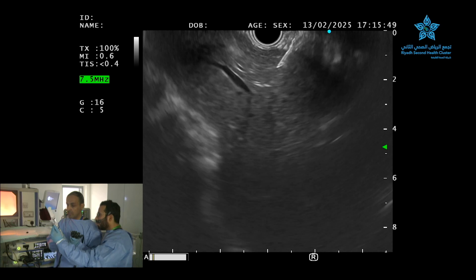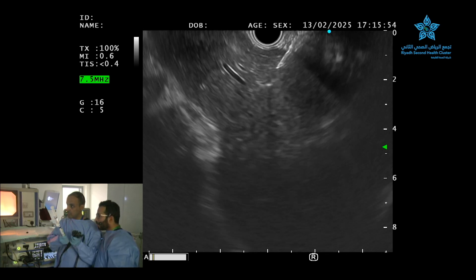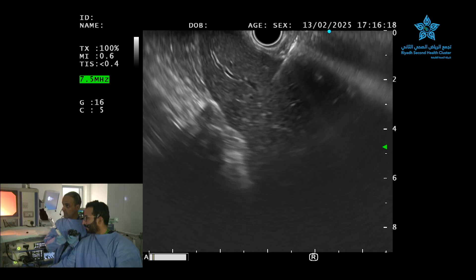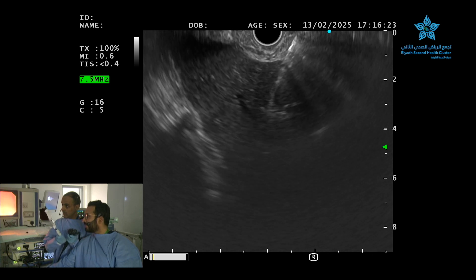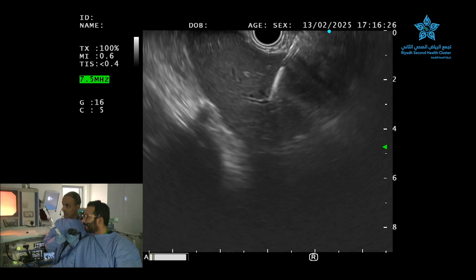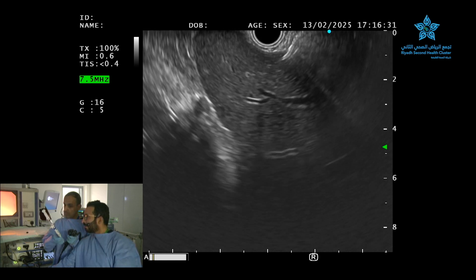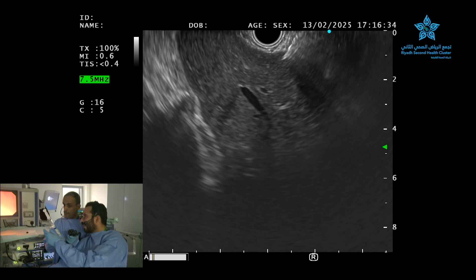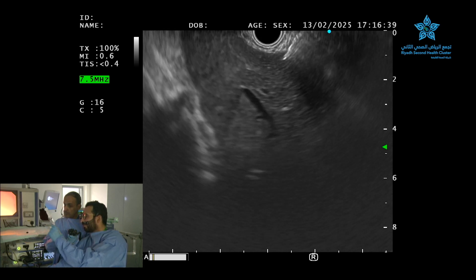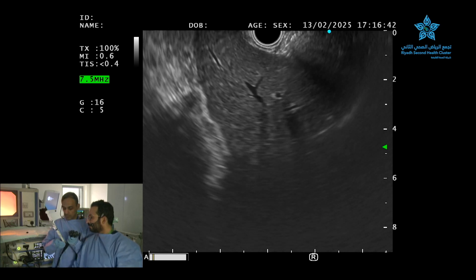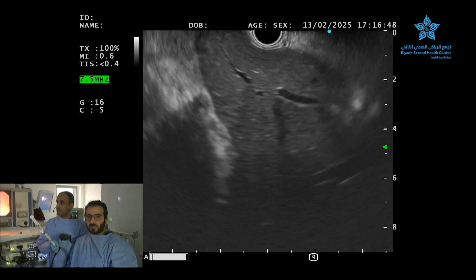Once the needle is in, we will open the syringe and start the negative pressure. Nawaf will go all the way. We are using a 10 cc negative pressure syringe. Then we get the needle out.